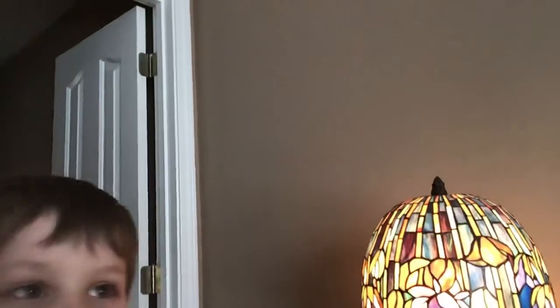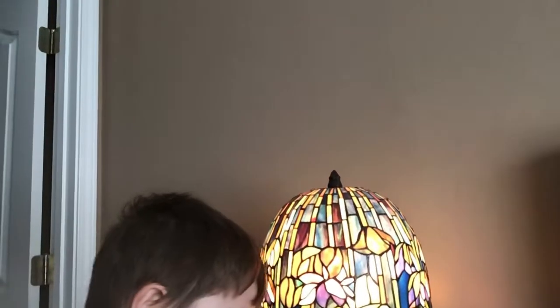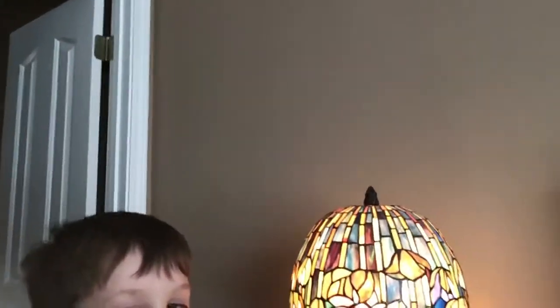You turn it on. See, it's smoking? Yeah, it's working. You turn it off and back on. You know how to do that real well because you do it all the time, don't you? Yep. Turn it on and off. Good job.